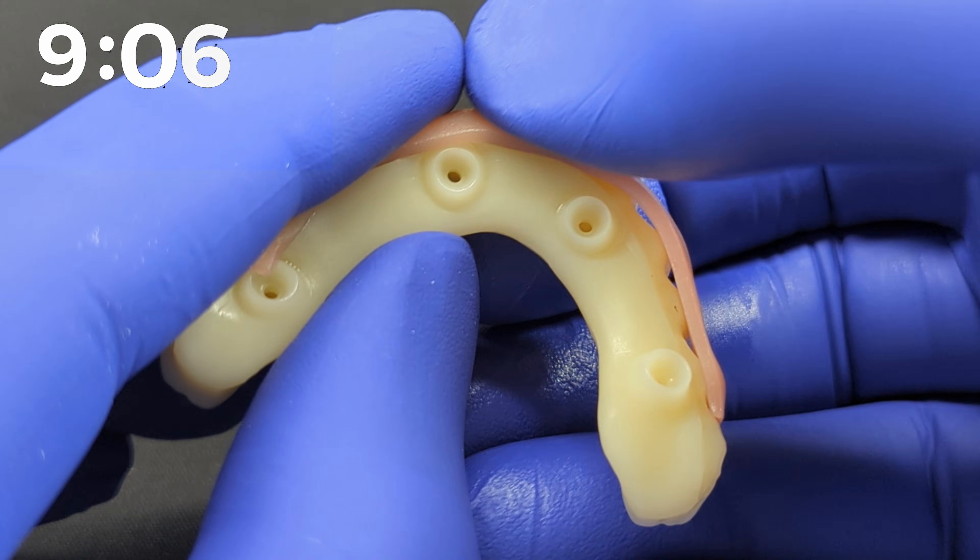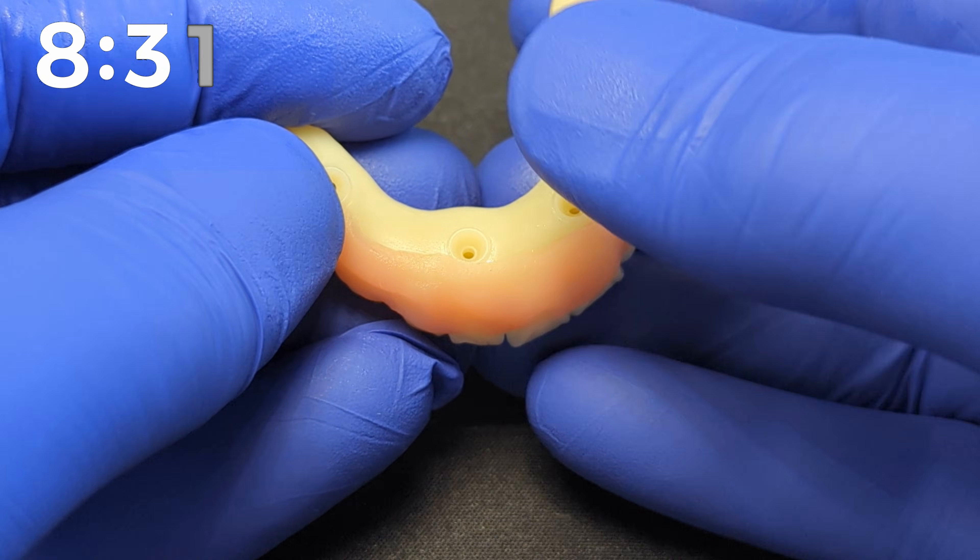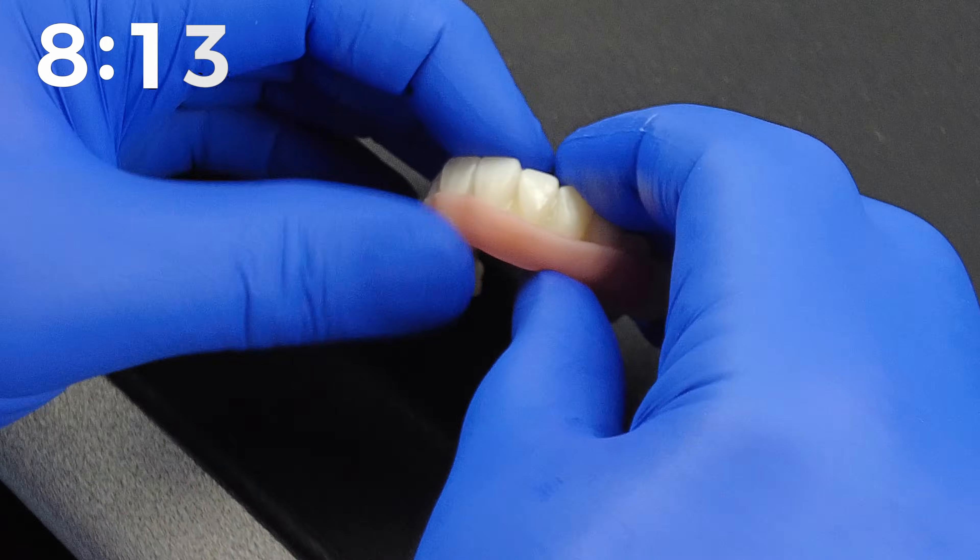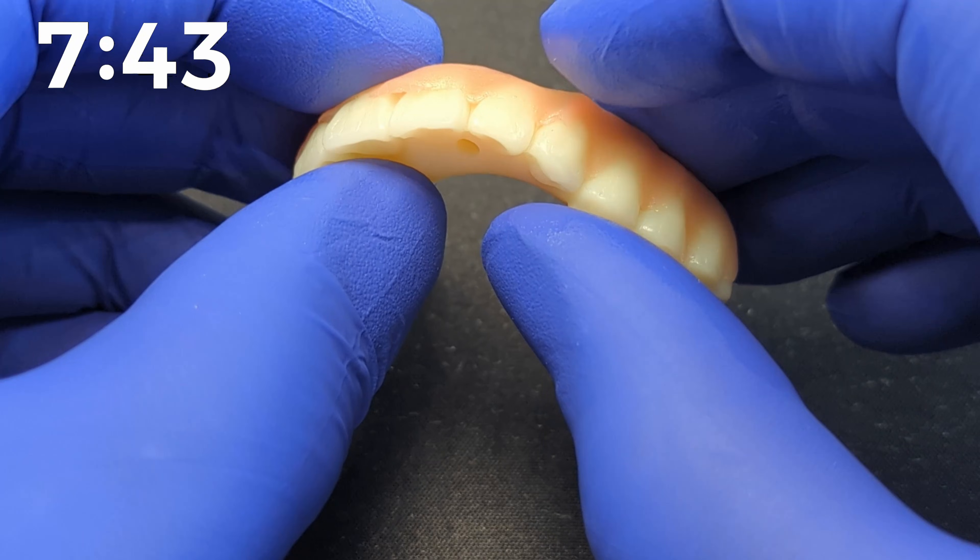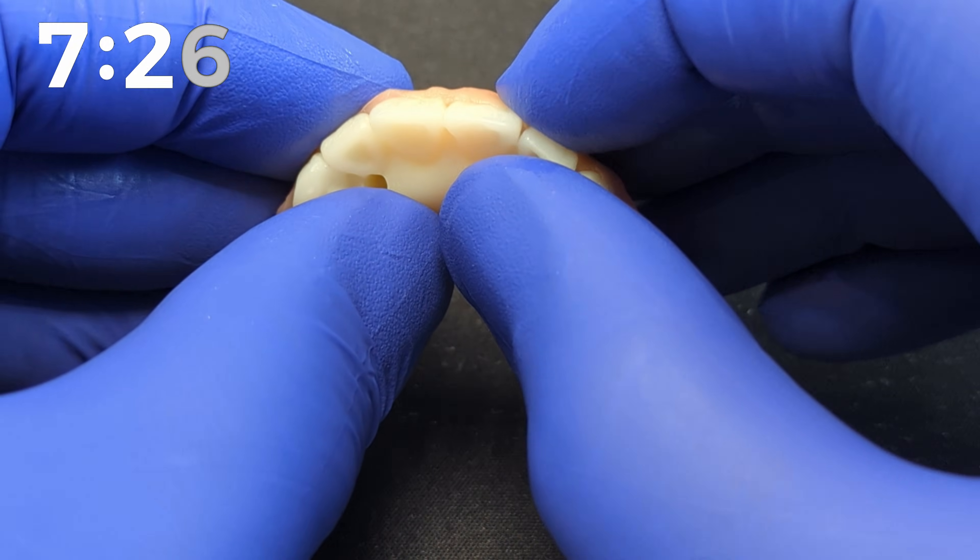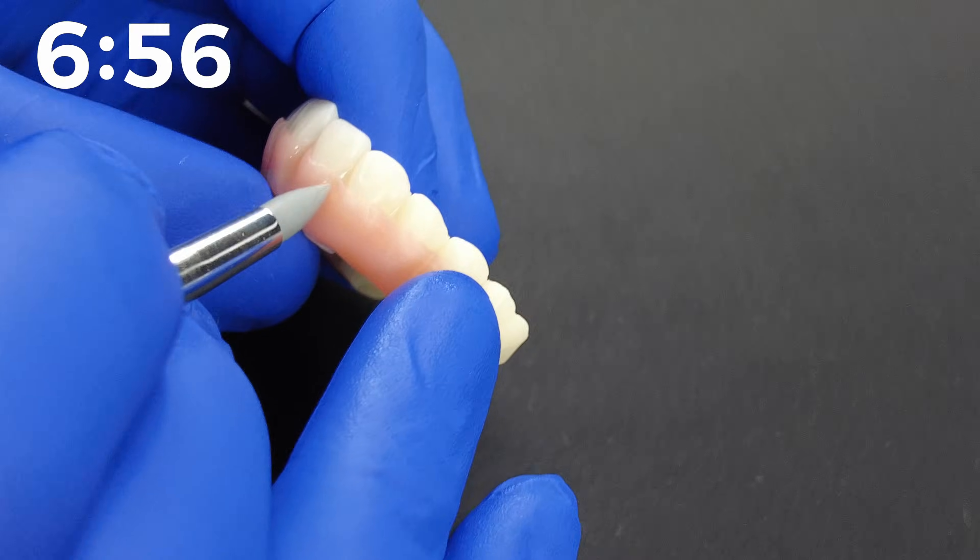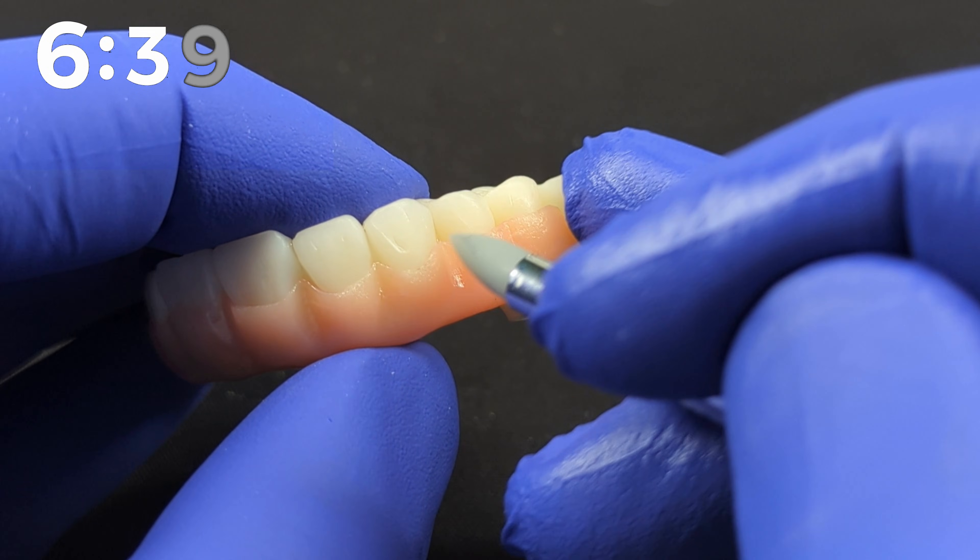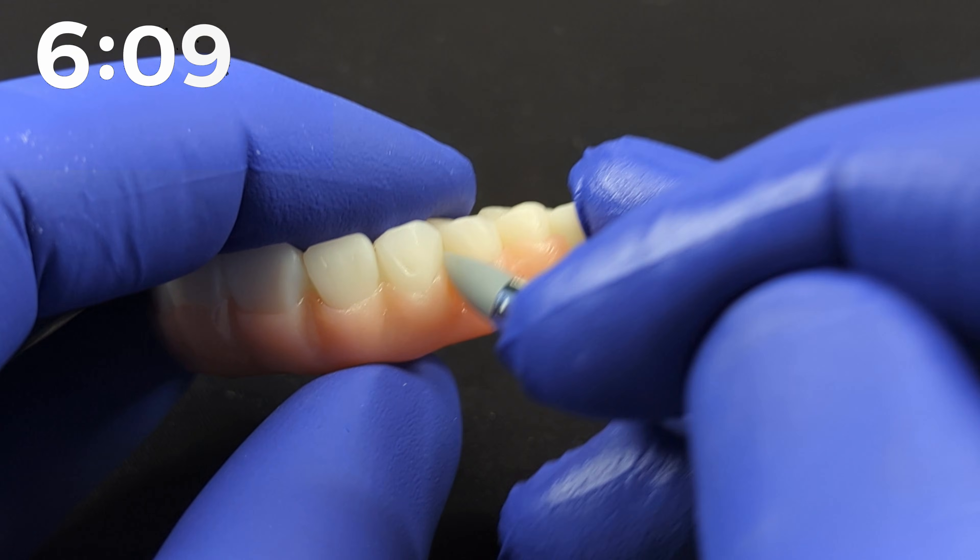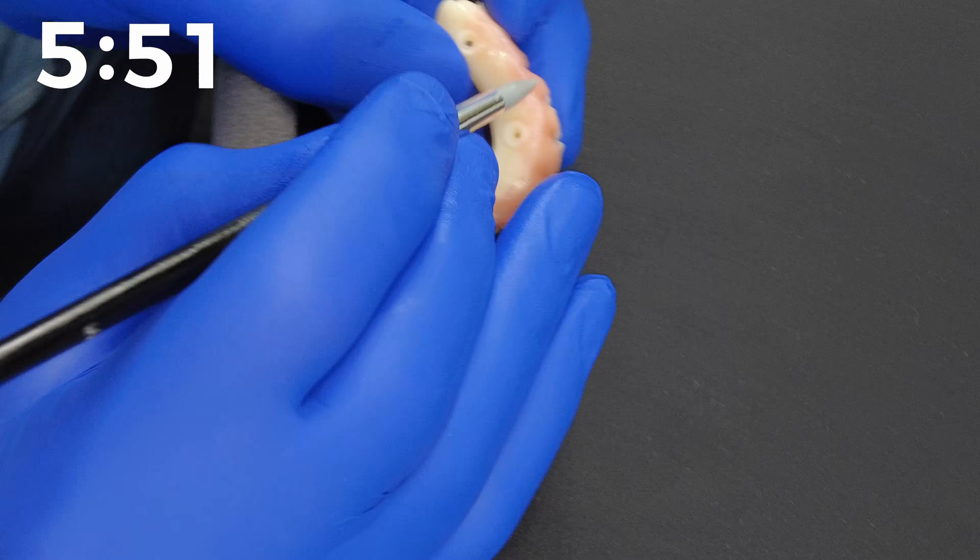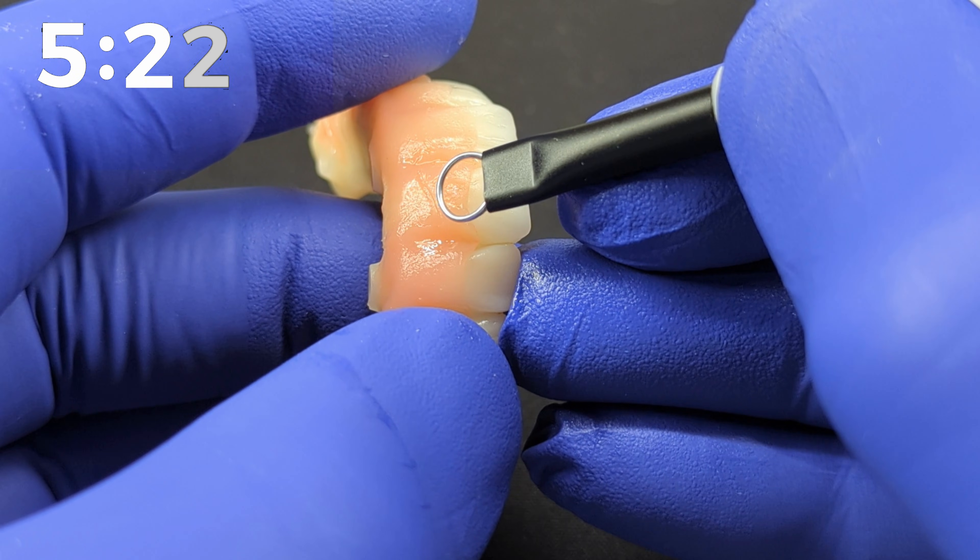First, position the EasyGum strip in the middle of the appliance and press it down gently. Avoid pressing too hard to prevent thinning the material excessively and pushing it into the teeth and the basal surface. If there isn't enough material at both posterior ends, don't worry, there will be plenty of leftover material to reuse in those areas. Next, carefully press the material into the interproximal areas. Clay modeling instruments with silicone tips work great for this step. I wet the tip with Model LC from AnnexDent, and apply slight pressure to push EasyGum between the teeth. Then, with a swift motion, I smooth out the basal area, ensuring it thins out nicely.